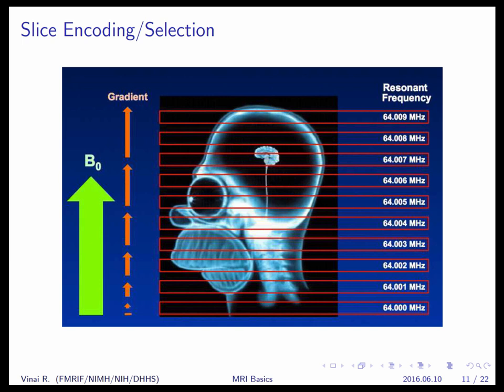I mean, there is what's called magnetization transfer with pulses. Sometimes people give really broad frequency pulses to get at maybe the molecules that are precessing at slightly different frequencies. But that's a different thing, that's a contrast. There are other things that determine tissue contrast, not this itself. It's the relaxation rate. It's not the frequencies, but how quickly they relax, either longitudinal or transverse relaxation, which will be covered. Okay, thanks, Peter.